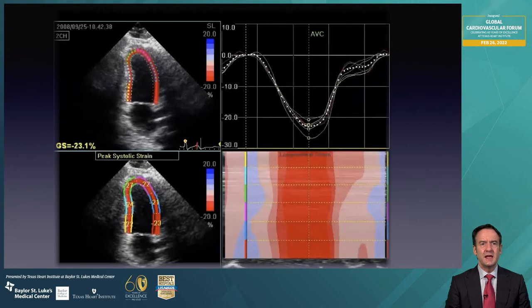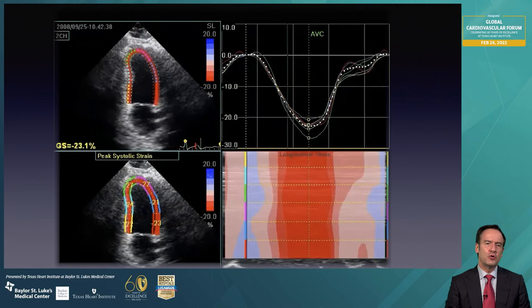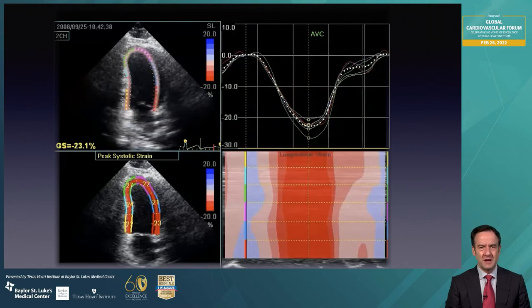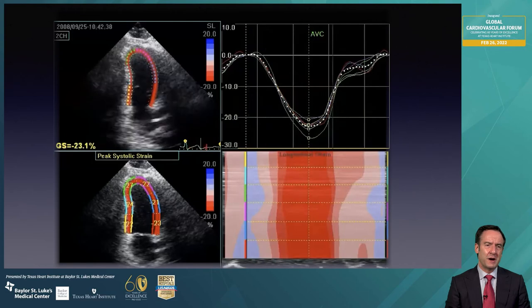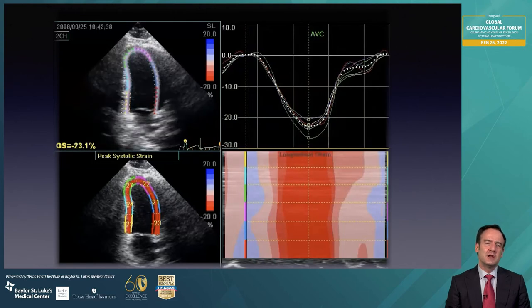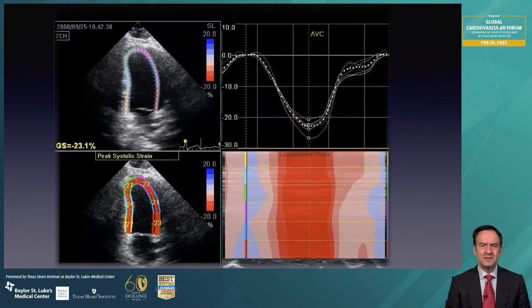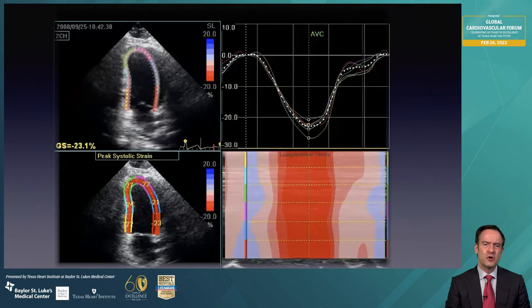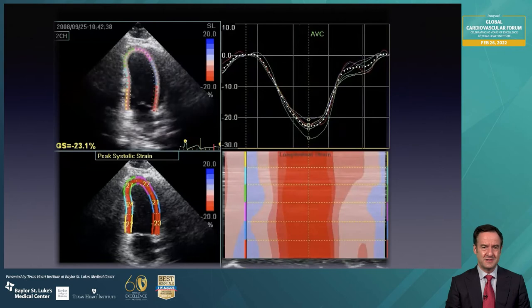In terms of the display of the strain, it's color-coded. You will see red if the strain is appropriate, and blue if instead of shortening you are having elongation. You can appreciate in the left lower panel individual strain scores for each segment of the heart. On the right side, you have the curves of deformation and the color M-mode, showing that all segments are achieving maximum deformation at the same time.